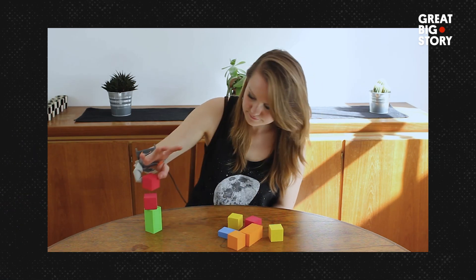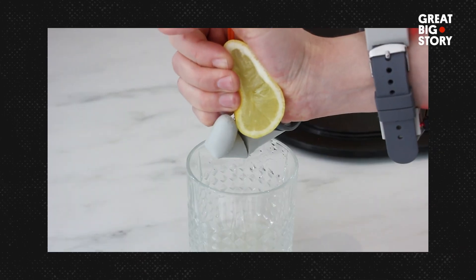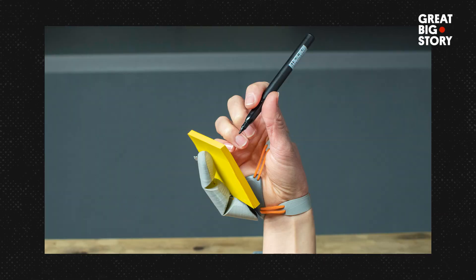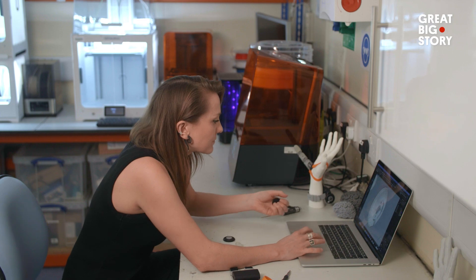What I really envisioned for the Third Thumb is more specific workplace applications that require a slight redesign. For example, I've spoken with a shoulder surgeon who was really interested in being able to hold multiple tools at the same time, rather than collaborate with an assistant.